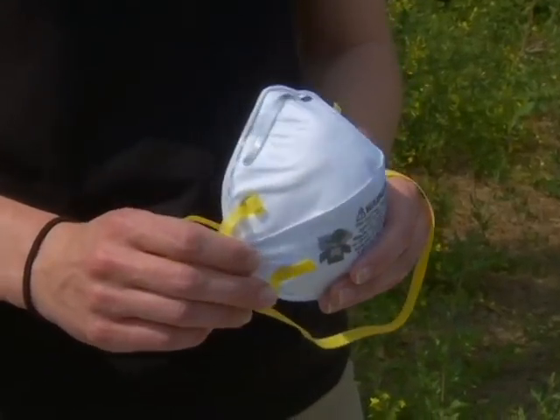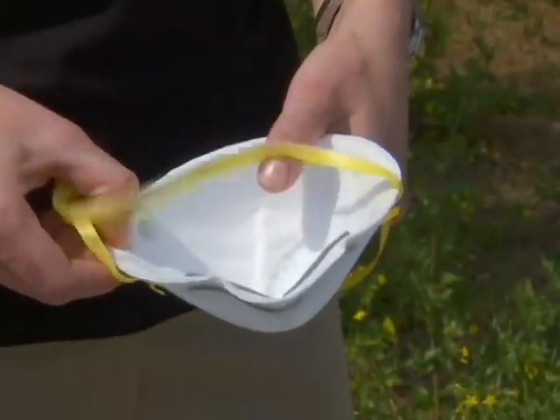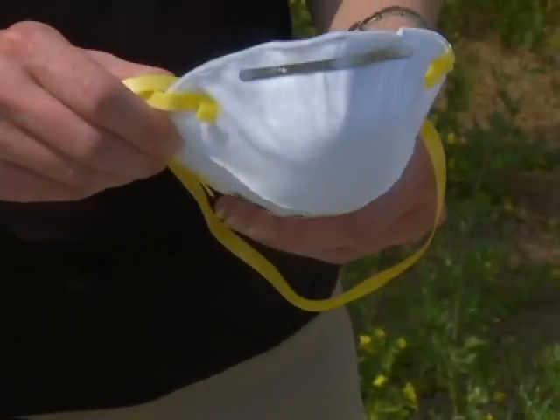Here are some general instructions. Wash your hands prior to handling the respirator and inspect the respirator for tears or damage. If your respirator is folded, open the folds fully.